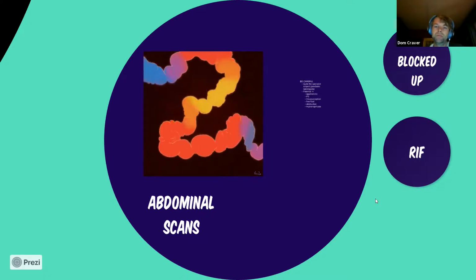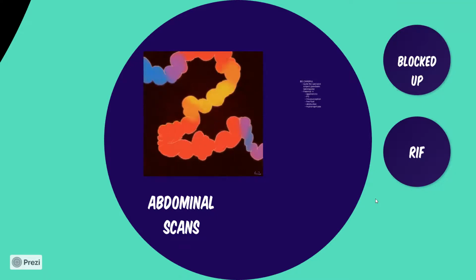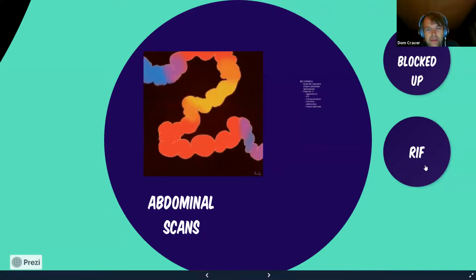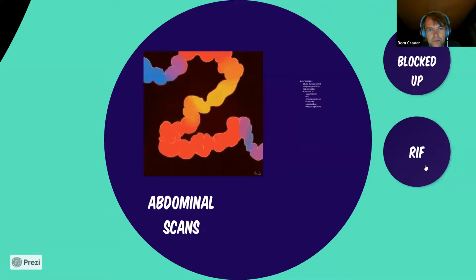Fantastic cases. And as you say, just expediting the care in itself can sometimes be really important with these cases. Yeah, and I think that's the most important thing in most of the cases I'm talking about. A lot of PoCUS changes the pathway of a patient, like the child who had the mediastinal mass, it really changed their pathway from quite early on. And that's one of the things why I love ultrasound.